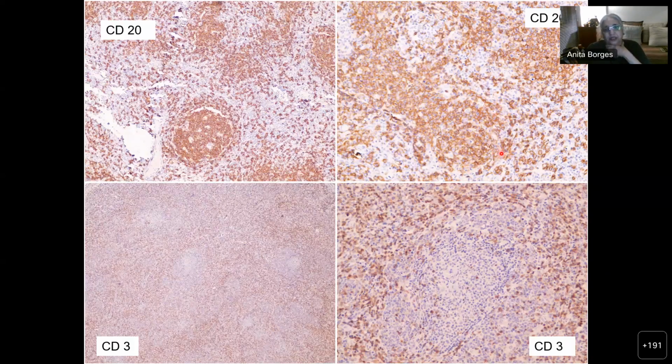Now here is a follicle. It has to be a follicle, because it's B. There is something like a mantle, but there's no reaction center at all. It looks very different from this. This one looks as if it is dying out, like an atretic follicle. So you've got collections of B cells with large B cells forming clusters like that. You've got proper follicles with germinal centers and others which do not have them. It's a very strange kind of reaction.